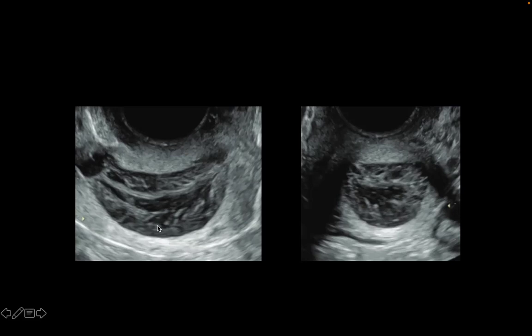Here, what the authors also appreciated was this unusual thickening of the endocervical mucosal layer. If you see here, there appear to be folds or ridges in the endocervical mucosa, which you can appreciate even in this transverse image. So this central part is the cervical mucus. This echogenic part would be the endocervical mucosa, which is thrown into folds. And when they switched on color Doppler, there was no vascularity whatsoever, which is very reassuring.